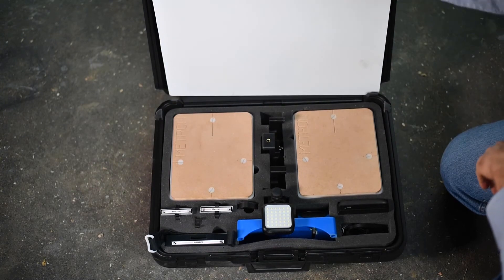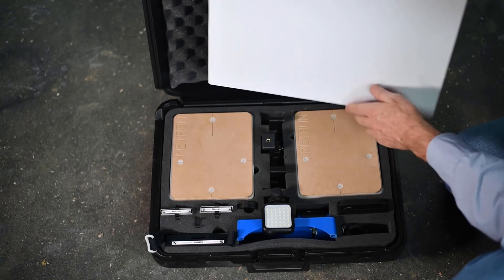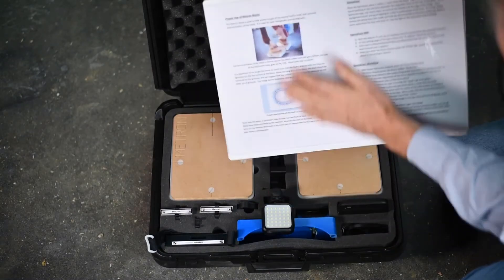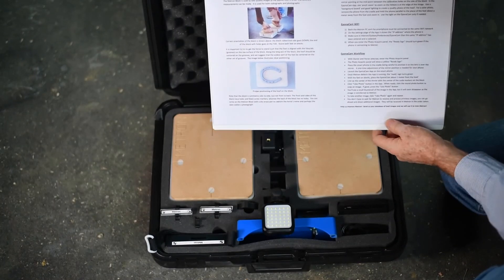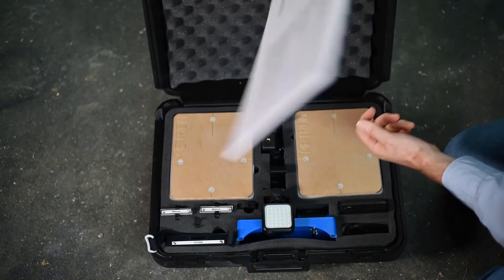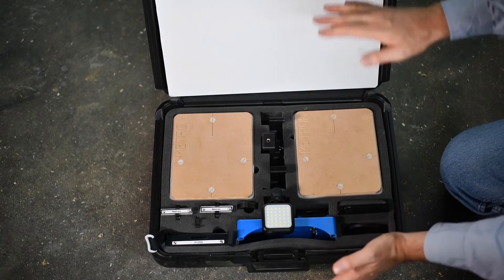There's also a so-called background board — just a white neutral board. You hold it behind the block so when you image the foot in a photograph, you have a nice clean background. On one side of the board are instructions telling you some of the things just described, showing you the best way to position the foot, and so forth. So all that is what's in the hardware kit, along with a nice carrying case you can bring along with you.